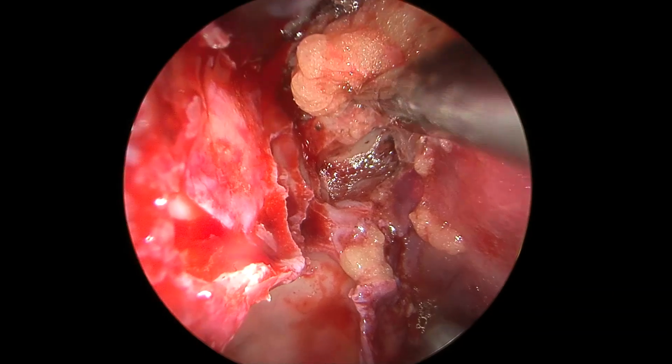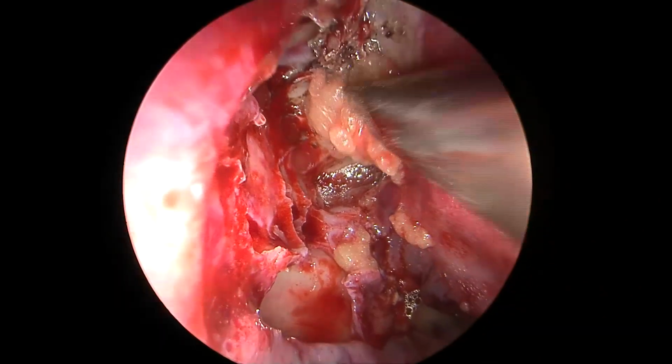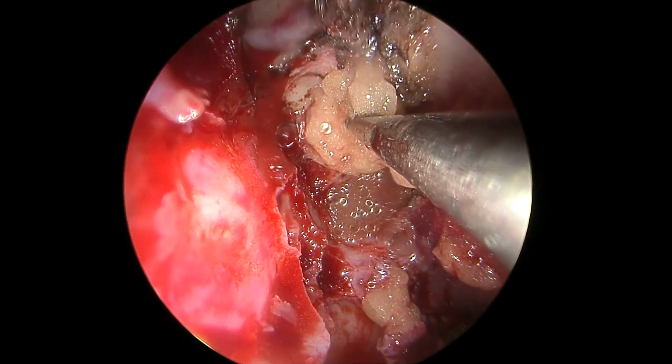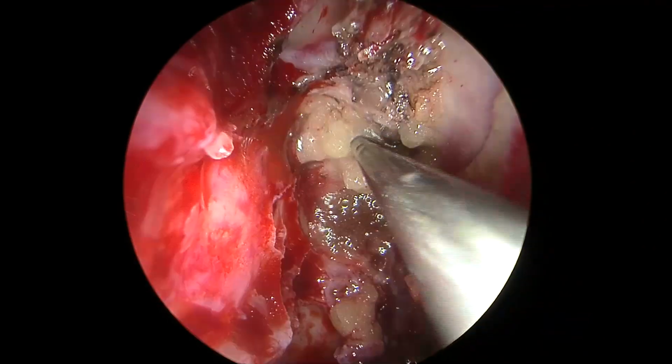So you see here we're using a fat graft. We obviously take a little bit of an oversized fat, and once we insert it nicely and tightly, if we feel that the fat is too big or protruding, we can take a fine scissors and trim some part of it while the rest of it is actually inside.